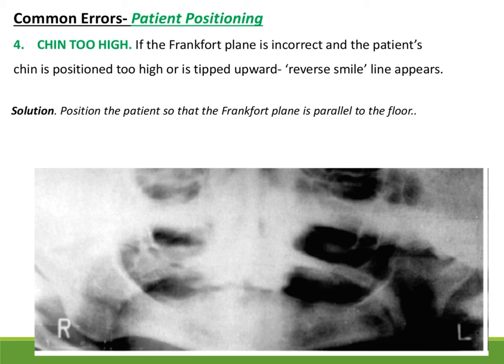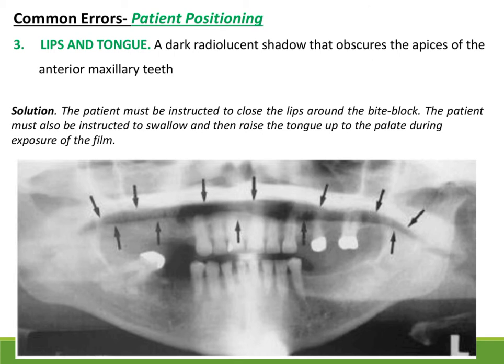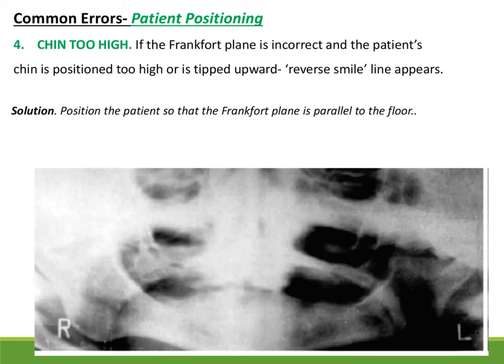Now it's about the patient positioning. Previously it was about the patient preparation, and now we have come to patient positioning. The first one is chin too high.